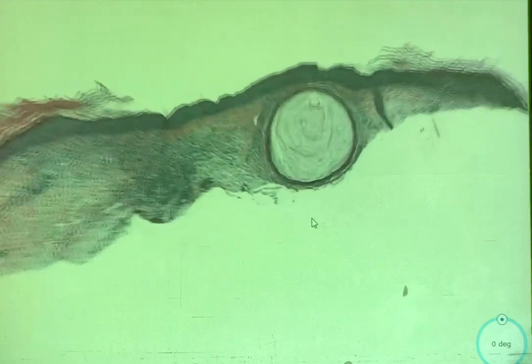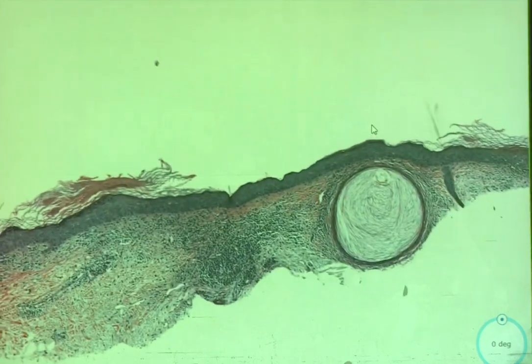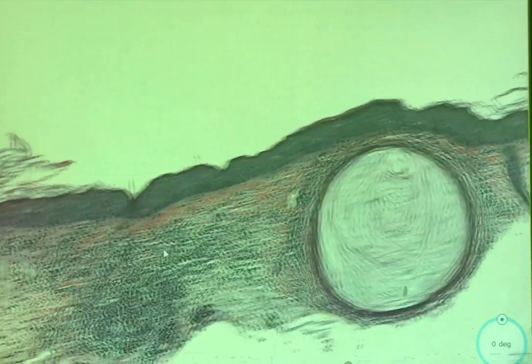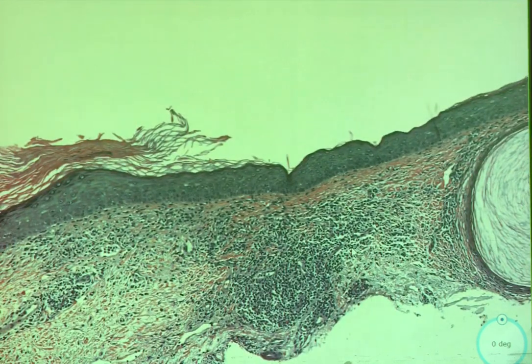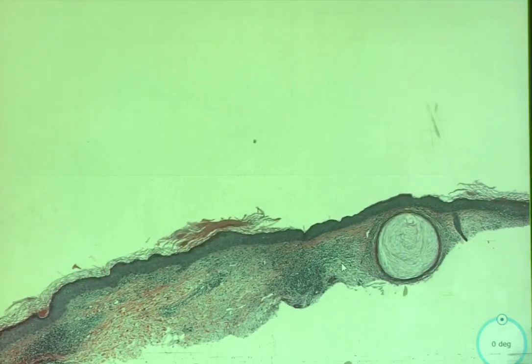Is this something? That is something. Is it like a keratin pearl or something? Yeah, that is keratin, and that would make you think of squamous cell carcinoma. How about seborrheic keratosis? It kind of looks like a pseudocyst, right? Yes, but that's like keratin. Exactly. And what else can we see? So we're going to go closer. From a distance, there are some cells here and some here, but I don't see anything majorly atypical.